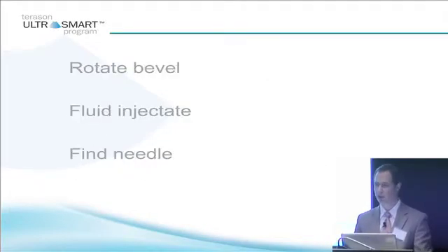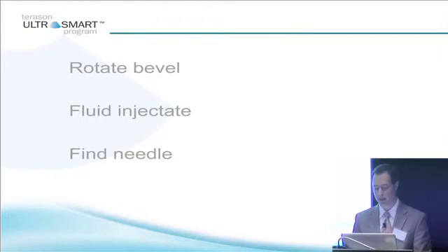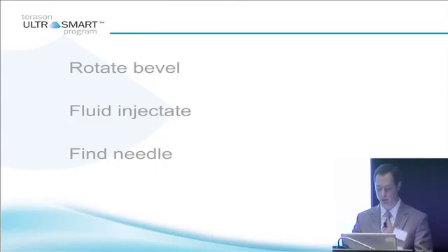To identify your needle, you can use techniques such as rotating your bevel, injecting fluid, and also holding your needle perfectly still while you move your transducer — I would certainly recommend that. The key is: if you lose your needle tip, don't advance the needle. Find your needle tip with your transducer, keep your needle still, find your needle tip, and then move your needle.